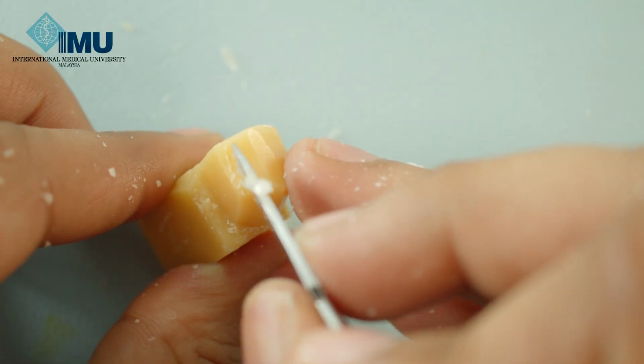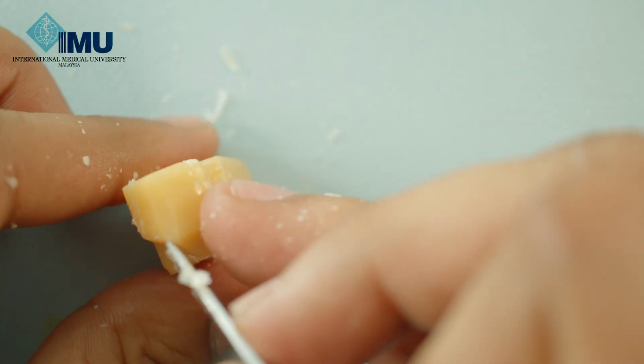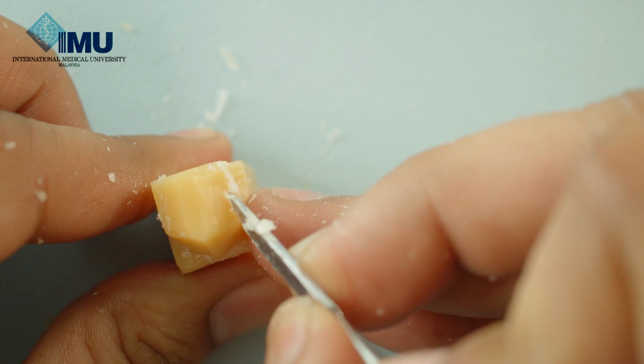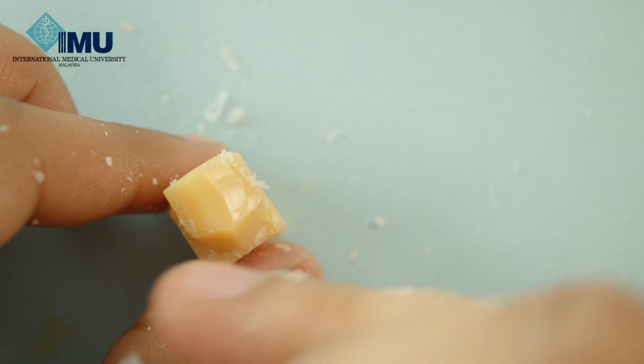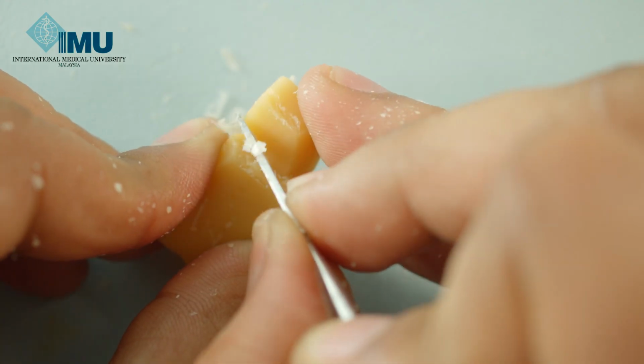So you can see that I have drawn a line here. Similarly, I have drawn a line on this side. So we'll start reducing the wax on the lingual side.